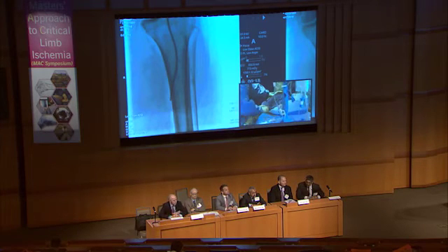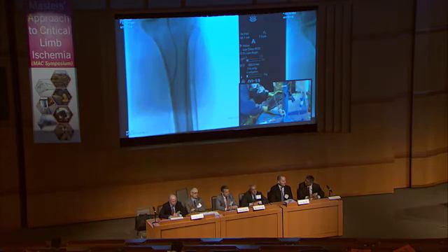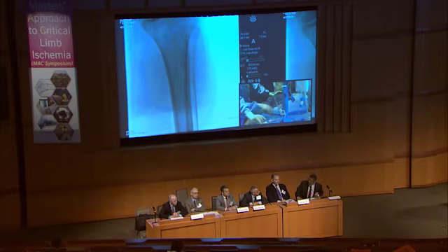Thomas, I have to do a debate on maybe it's possible to avoid the angiosome concept at the upcoming conference. So do you believe in it? Because if we believe strictly in the angiosome, you have already treated the artery that is feeding the ulcer. Do you need to go for the AT right now?